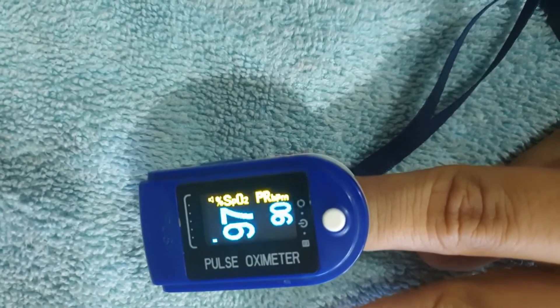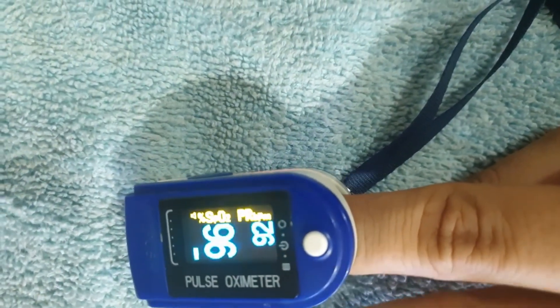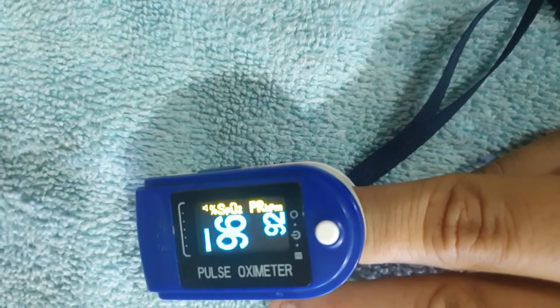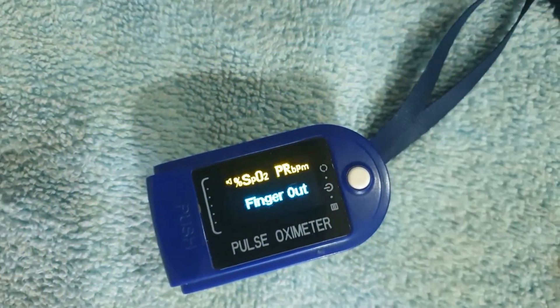There are two readings displayed. The first is the saturation of oxygen, written as SpO2, shown as a percentage. The second is PR, or pulse rate, written as BPM — beats per minute. Both readings are very crucial.